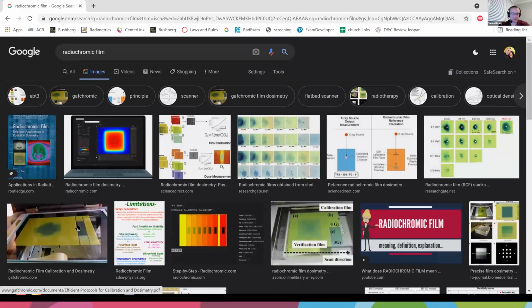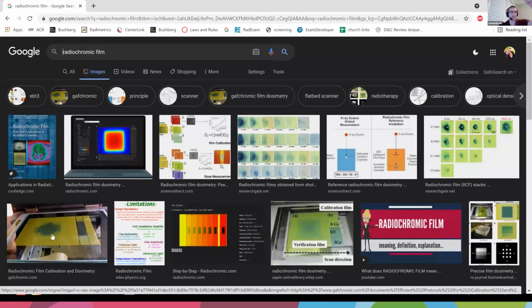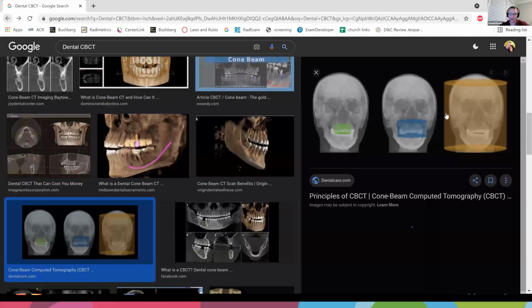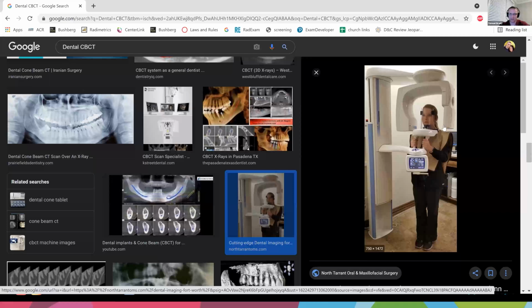Well, here's a picture. You can kind of see that it's film that you can actually hold. It's not regular film that would develop in normal light. It's film that you can only develop when it's irradiated. So you can actually just tape it to the detector side. You have the detector over here and the X-ray tube. So you would physically tape the radiochromic film to this side. Take everything out of here. Take the little stand, take all that out, so it's just a clean shot. Acquire one image, and then you'll see just a vertical line, and that's the field of view. You'll be able to measure the top to the bottom. You'll know exactly how tall your system's field of view is.